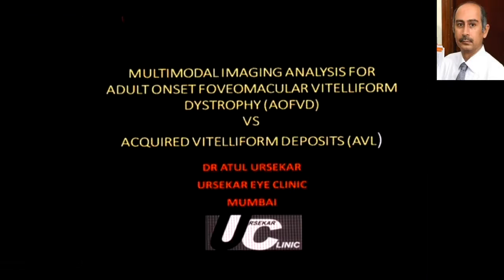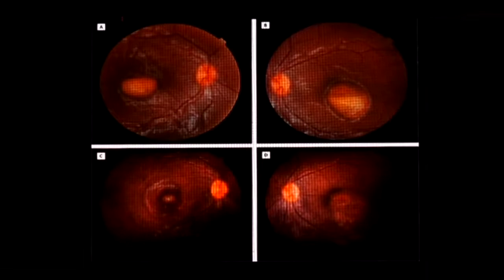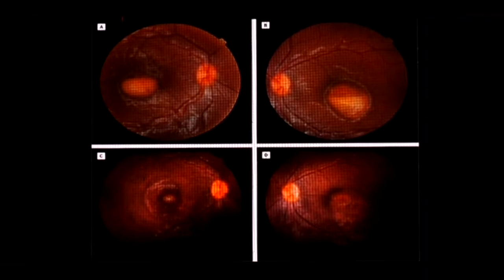The topic allotted to me is multimodal imaging in the analysis of adult onset foveomacular vitelliform dystrophy, compared to acquired vitelliform lesions. Now, as retina surgeons, we are all conversant with a vitelliform lesion as typically seen in Best disease, and we know the different stages. That is, you have the vitelliform, the pseudohypopyon or scrambled egg, and the atrophic phase.